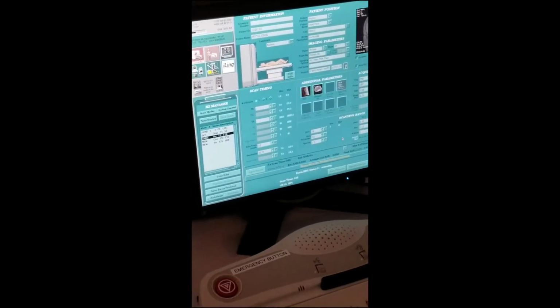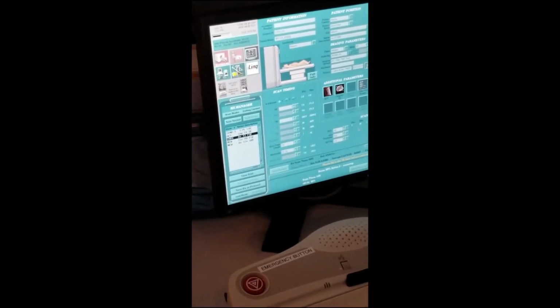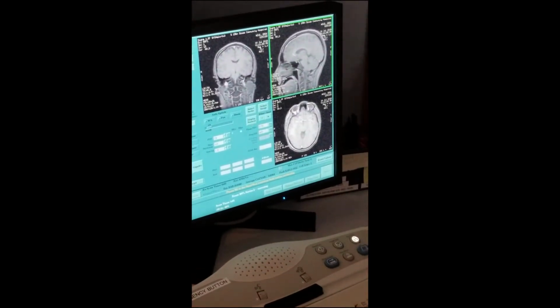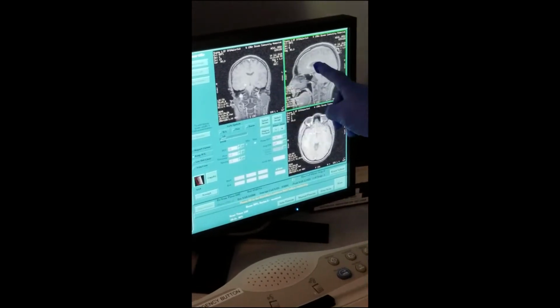It'd be nice if you talk. Say, I'm doing axial T2. Okay, so I'm now going to graphic RX. Axial, you're going to want to pull it off of the coronal. Well, we have the choice either coronal or sagittal.